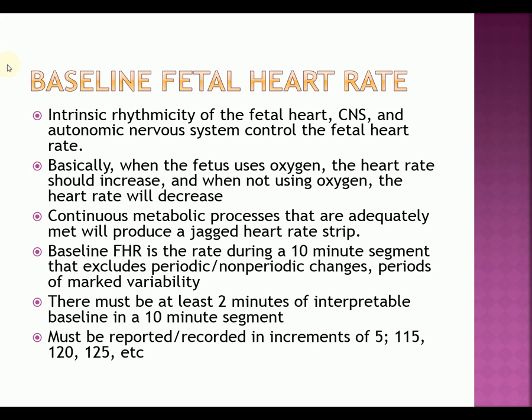After that, we round it to the closest 5 beats, and it has to be reported in increments of 5. This was another change that they made. We used to give ranges of 140 to 145, but now if the heart rate is 143, you would report 145. If the heart rate was 141, you would report 140. Because everything is only as good as the time that you're seeing it. Things can change extremely quickly. So this is the baseline fetal heart rate.